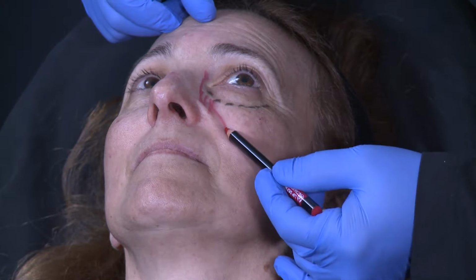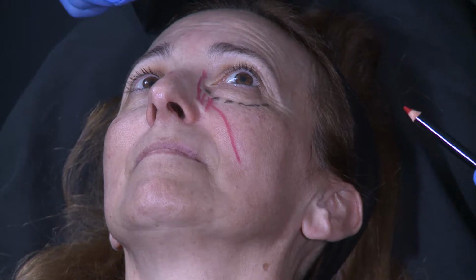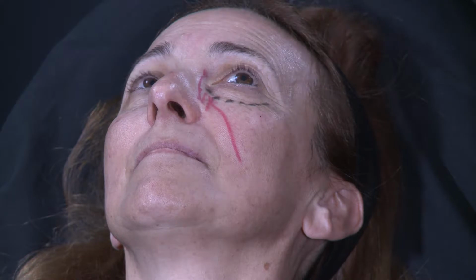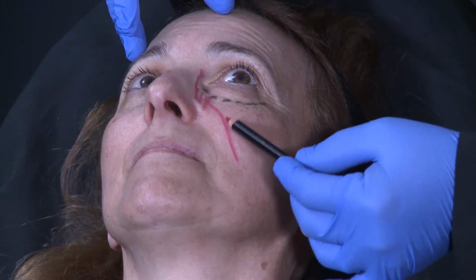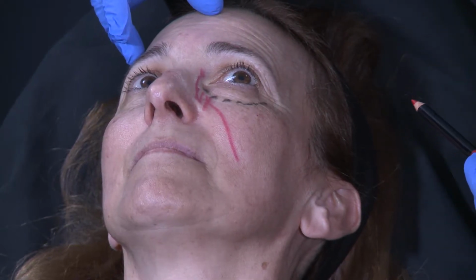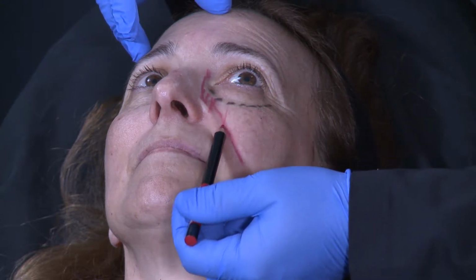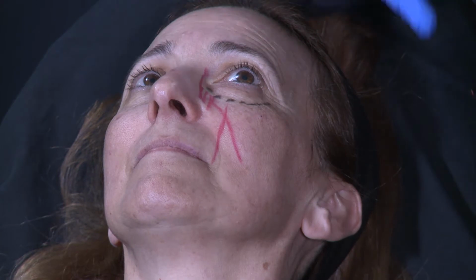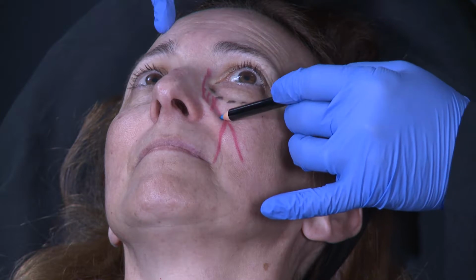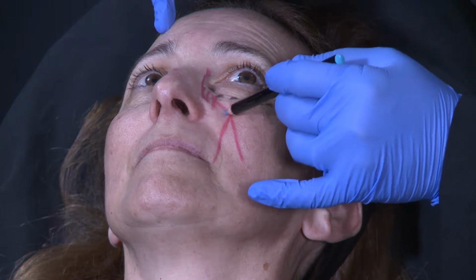In the mid-cheek groove, what you have normally in 80% of the patients, you have the facial vein. But the facial vein is not a danger, just only for the little bleeding you can have, but it's not a danger really for a big complication or an embolism. You have also here the mid-pupillary line, and a little bit at the medial part here, you will have the foramen of the infraorbital nerve.